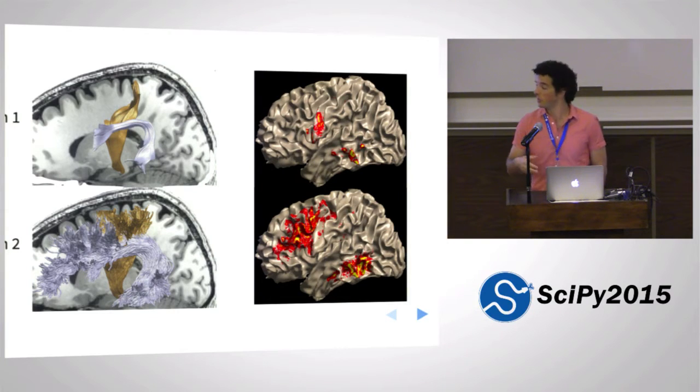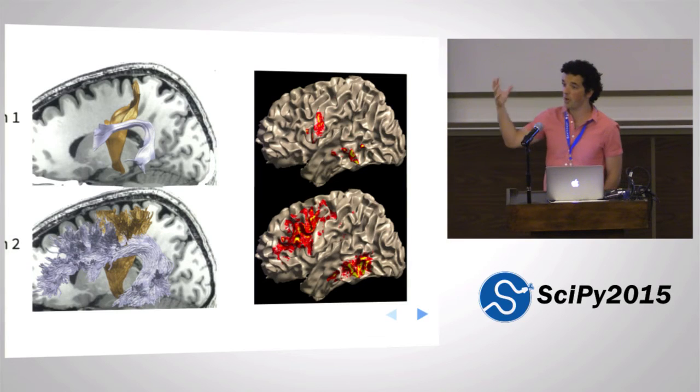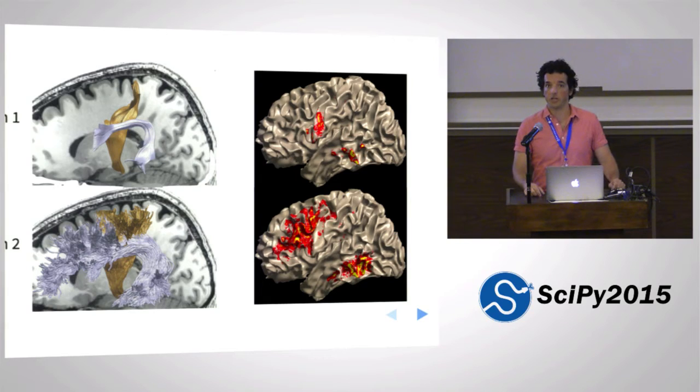Furthermore, when we look at, in this case, a surface of the brain from the side, the connection map varies quite widely also. So this is the connection map for this arcuate fasciculus. And you can see that the termination endpoints are quite different depending on what algorithm was used. So this poses a large challenge to us.